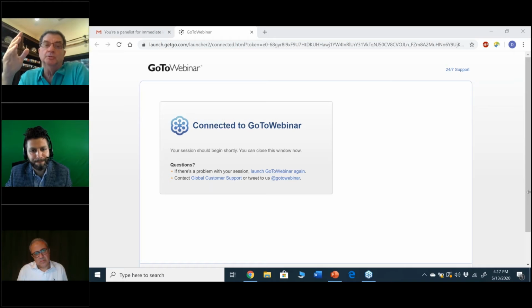I call it dual zone, dual graft therapy. So dual zone, yes, but dual graft. We might want the non-resorbable material in the bony part of the graft. In other words, up to the crest, the bone, like a xenograft, or something cortical like that. Like the chips that Elaskary talked about.